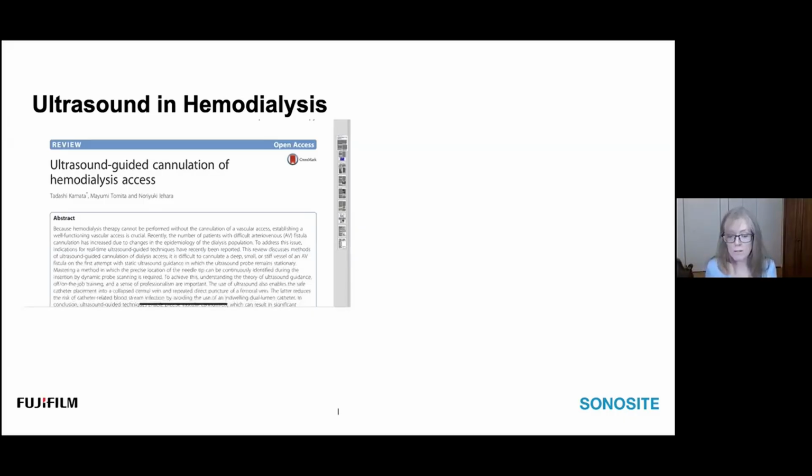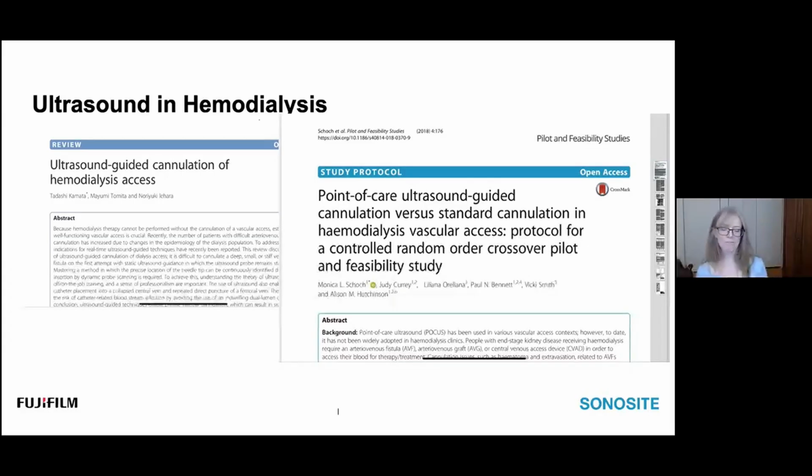And as a result, when they present in front of us for their first dialysis treatment and their initial cannulation, you're not looking at an access that makes you go, yay, that's huge, I'm going to have no problem getting the needles in. Instead you're going to look at it and go, oh, we've got a challenge here. So it suggests that use of ultrasound in those circumstances can help create positive outcomes. It also addresses the use of ultrasound for such things as central venous catheter insertions, but it does address arm accesses. So that's a good article for that reason.